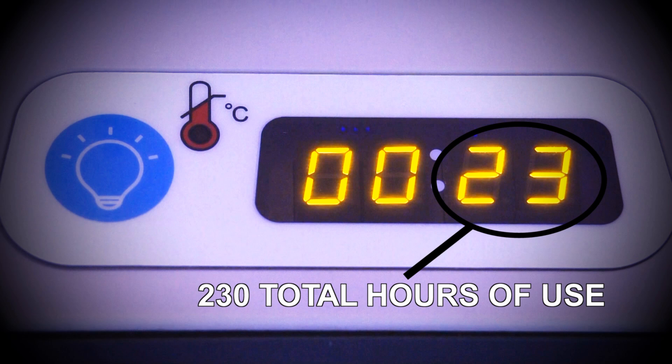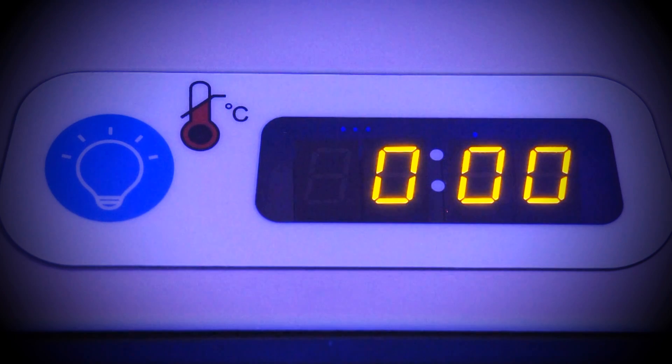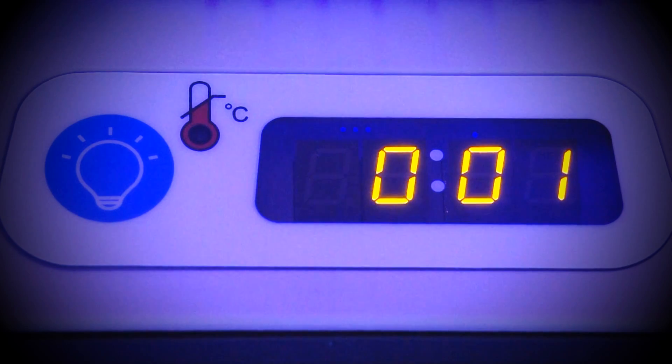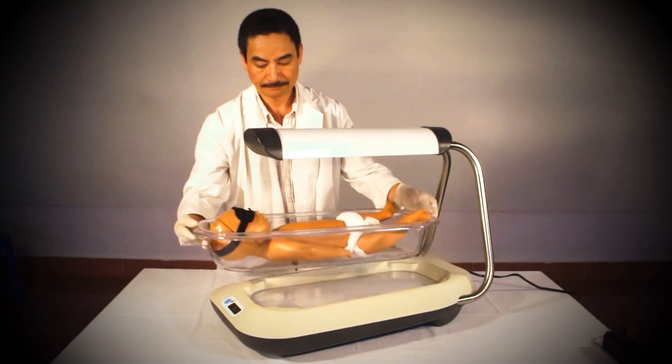For example, this device shows the number 23. After multiplying it by 10, we know that the device has been used for 230 hours. After three seconds, the total use number disappears and the display will show the counter for the current treatment session. The device counts up from zero and displays the time in minutes and hours. This counter restarts from zero each time the Firefly is turned off and on.